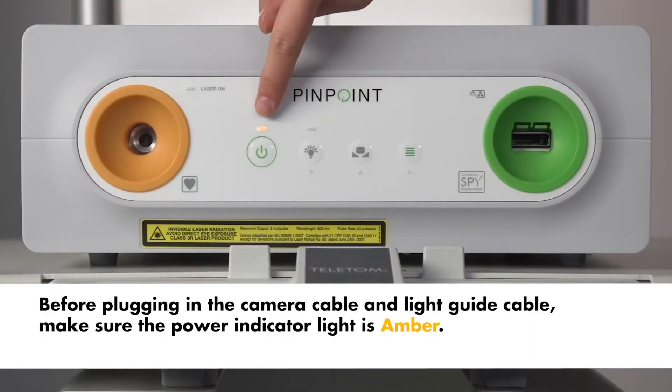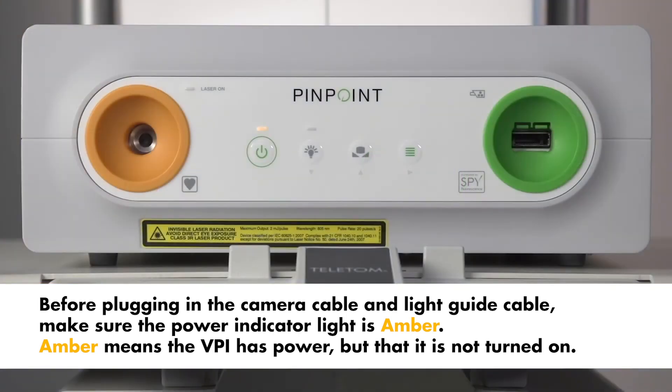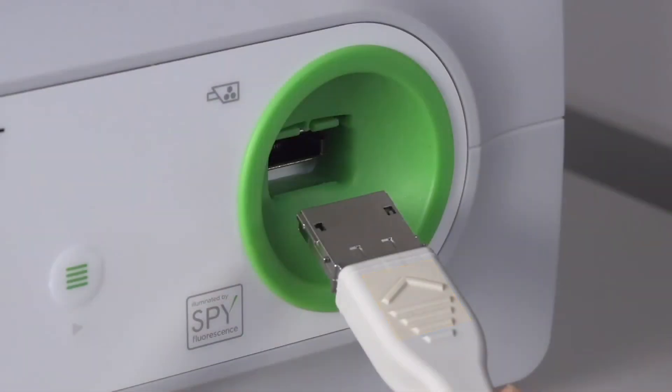Before plugging in the camera cable and the light guide cable, make sure the power indicator light is amber. Amber means the VPI has power but that it is not turned on. Remove the cap from the camera cable and orient the cable so the raised arrow faces up to properly connect it.